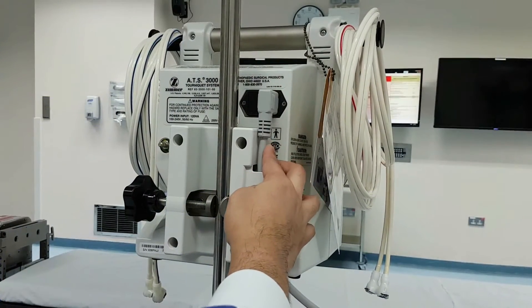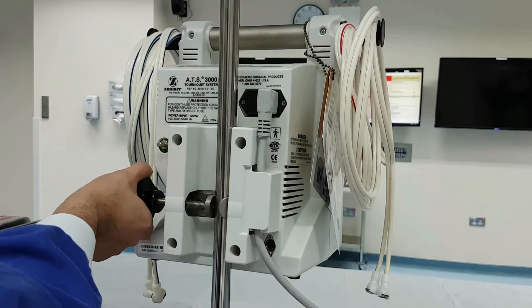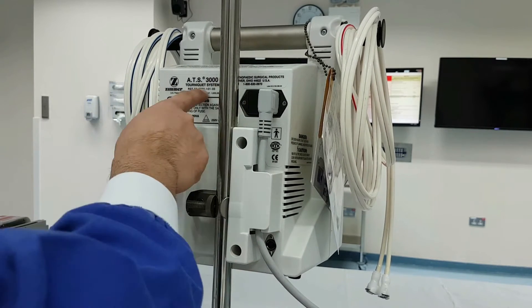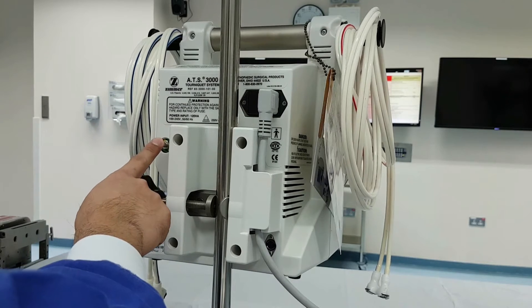Let's start at the back of the unit. You can see there your AC power plug, next up is your IV pole mounting screw, some details of the unit, and your power ground.